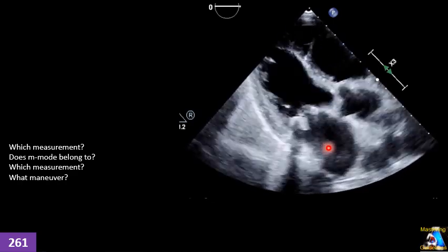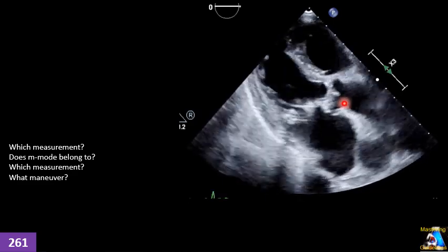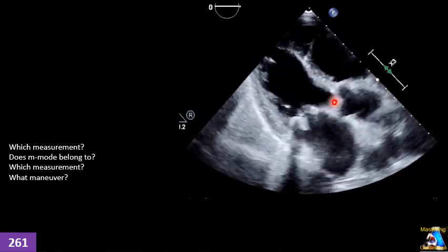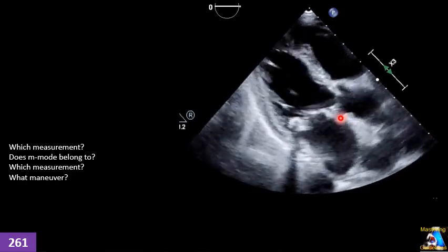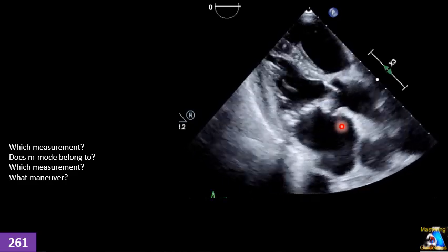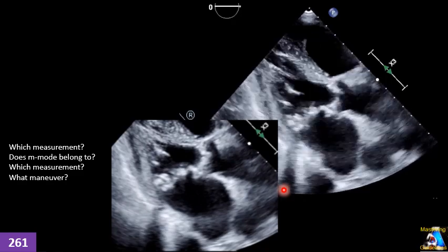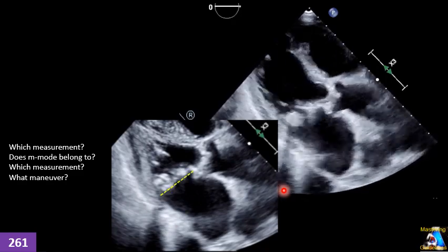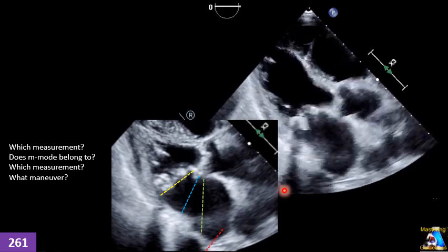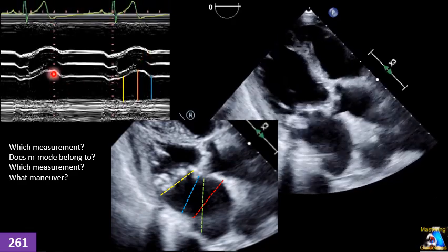Imagine you have a patient — a very difficult patient — and this is your best view and window for parasternal long-axis. If you want to measure left atrium dimension, the anterior-posterior diameter, which of the following is the correct measurement? This one? This one? This one? Or this one? Now we get M-mode here.